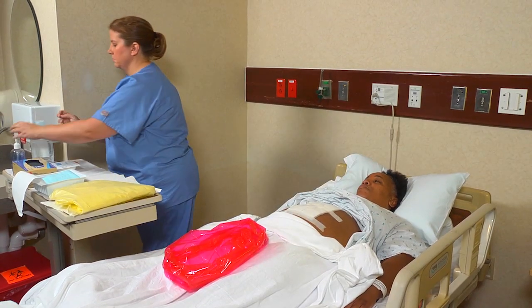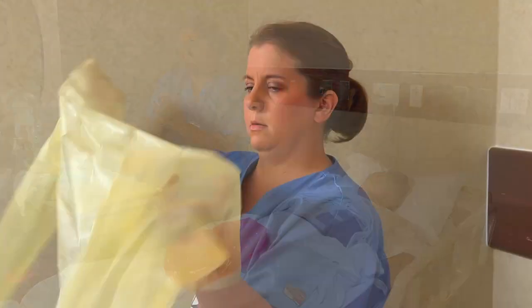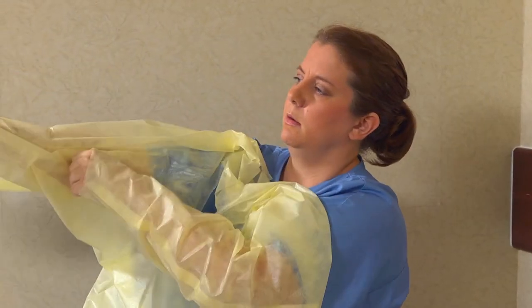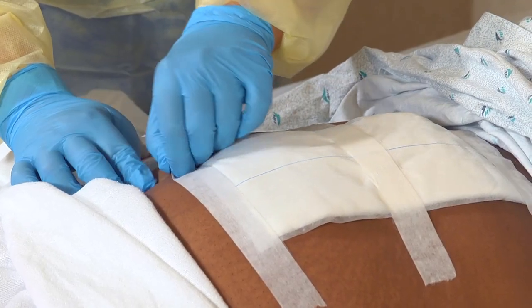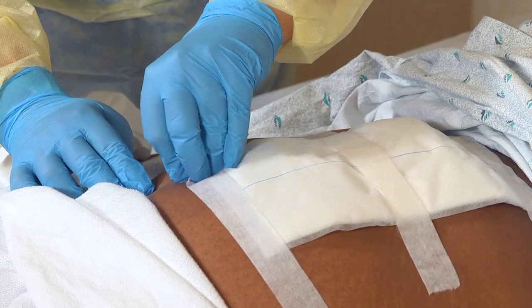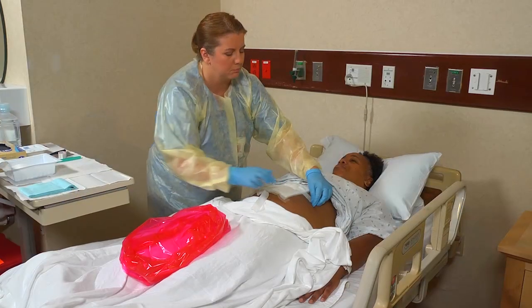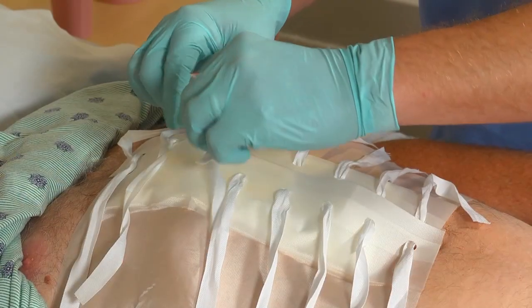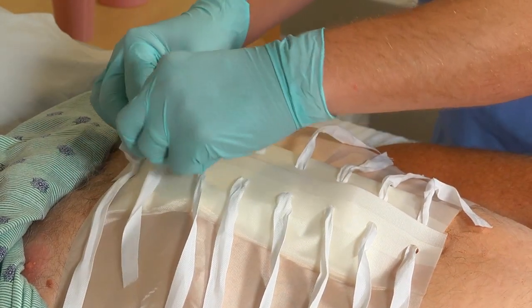Next, perform hand hygiene. Put on personal protective equipment as needed and put on gloves. Then remove the tape or undo the Montgomery ties. To remove the tape, hold the person's skin down and gently pull the tape toward the wound. To open Montgomery ties, undo them and fold them away from the wound.